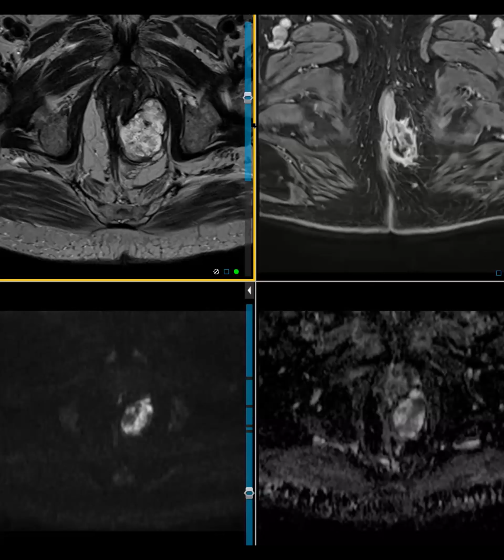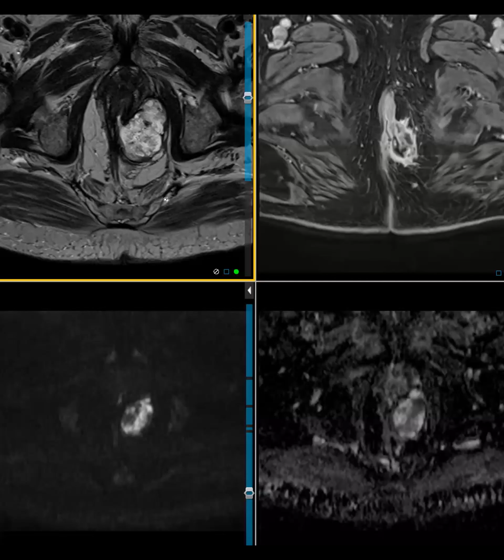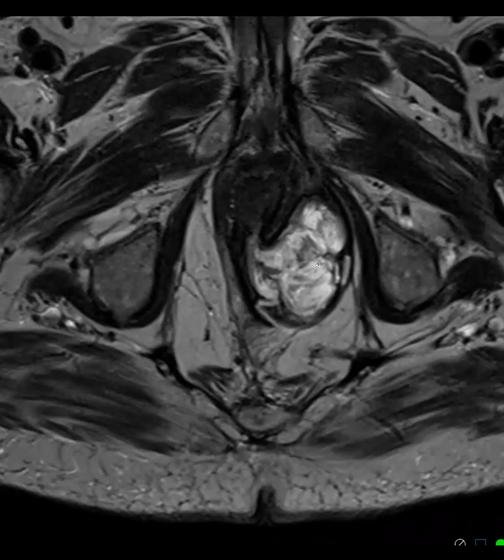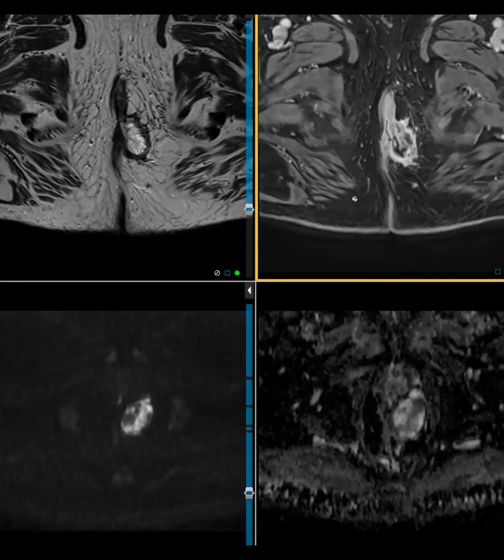Okay, so this is the second case. This is a 90-year-old patient, and this guy has a lesion in the pelvis, as we can see, a big T2 bright lobulated lesion, and we can see its communication with the anal canal. So it looks like this is continuous, and it's mainly in the ischiorectal fossa and ischioanal fossa. Okay, let's see. So below it's going into the ischioanal, upper ischiorectal fossa or fat area.